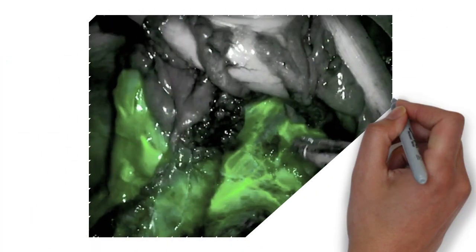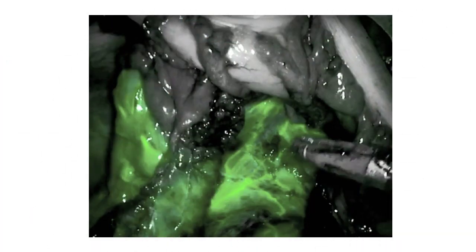When this information is displayed on a screen, the surgeon can easily see which parts of the body are receiving adequate blood flow, and importantly, which areas aren't.